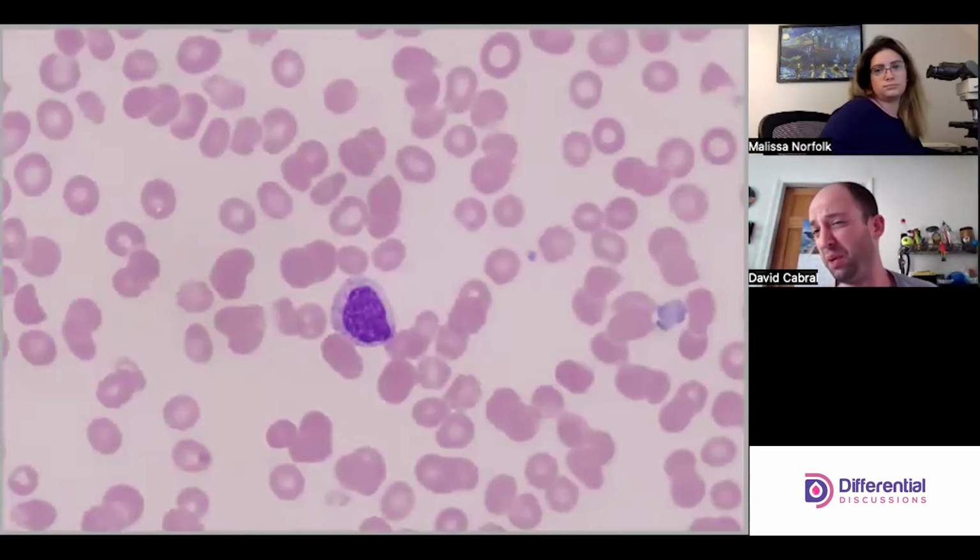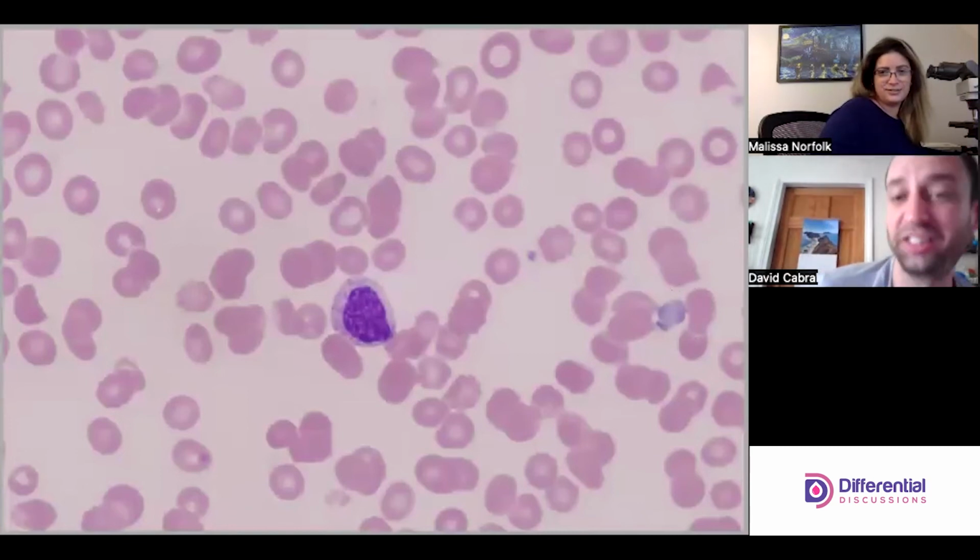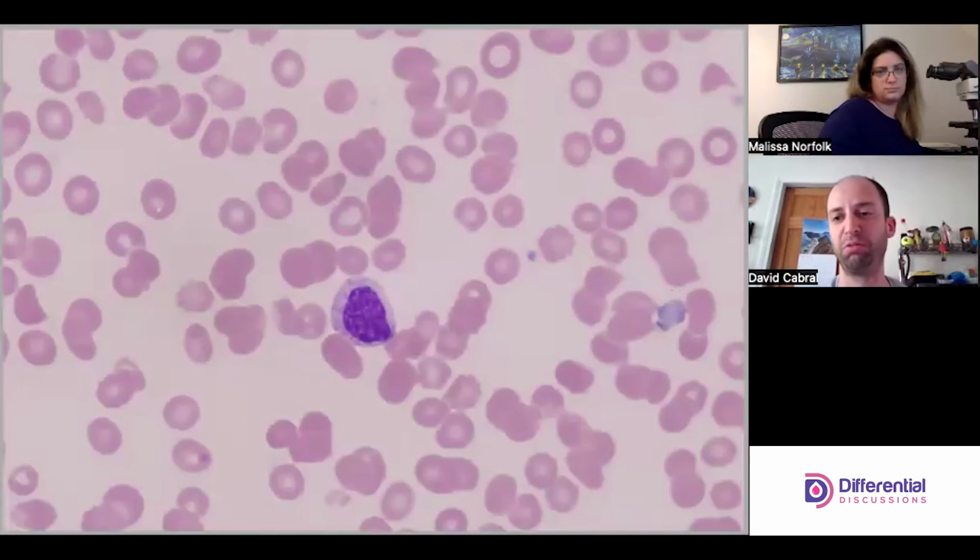There's a platelet without any granules. You see that? He's big. So, yeah. But he's big. Yeah, right. And so there's something to kind of look at. Some places will report a hypogranular platelet. The implication is that the platelets may not function as they should.